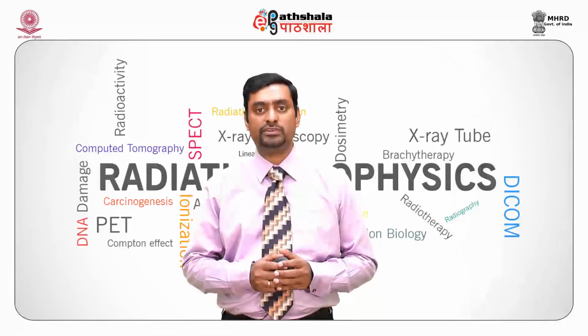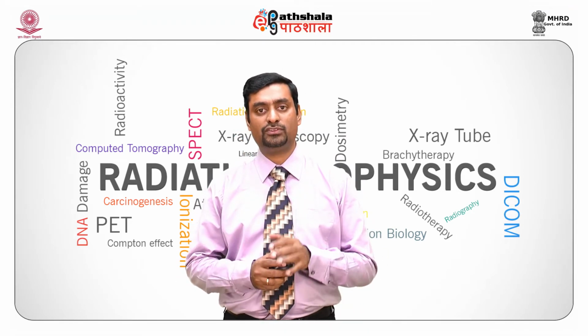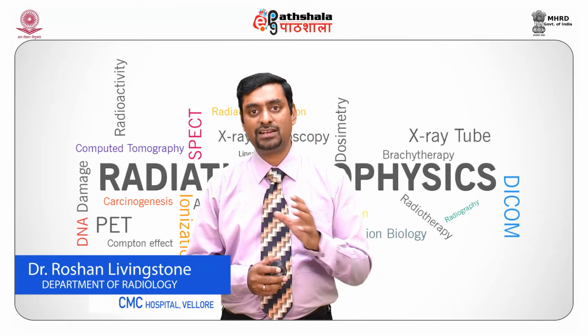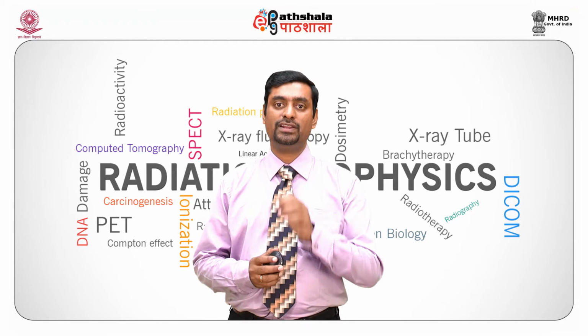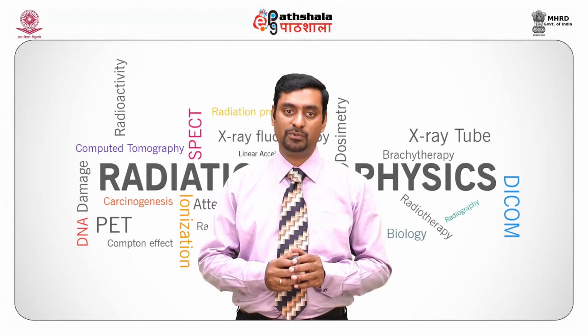Till now what we saw was the input phosphor converts X-rays to light. The photocathode converts light into electrons. Electrostatic focusing lens will attract these electrons towards the output phosphor, and finally the output phosphor converts the electronic image into a light pattern. This light pattern should be captured using optical coupling.